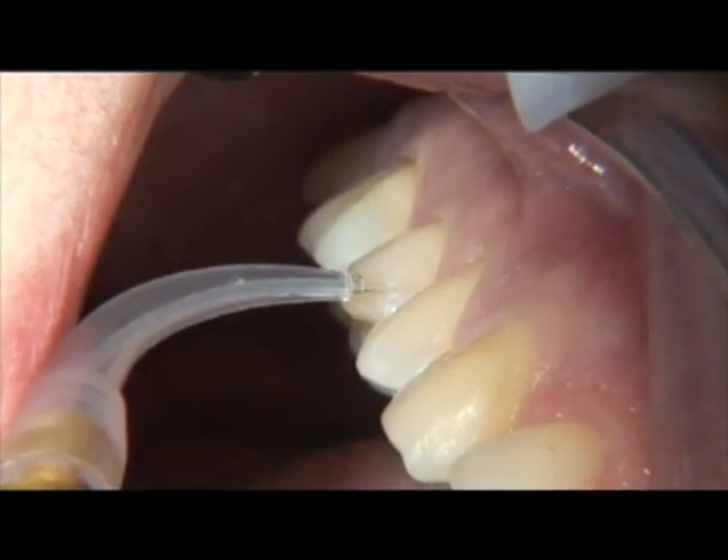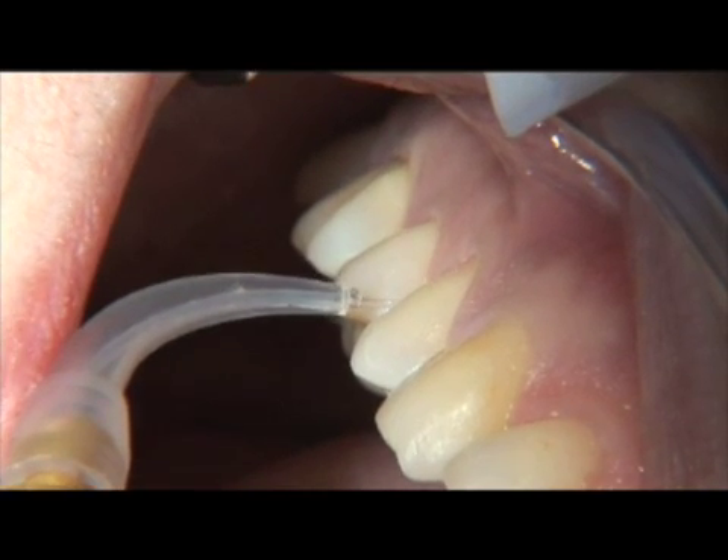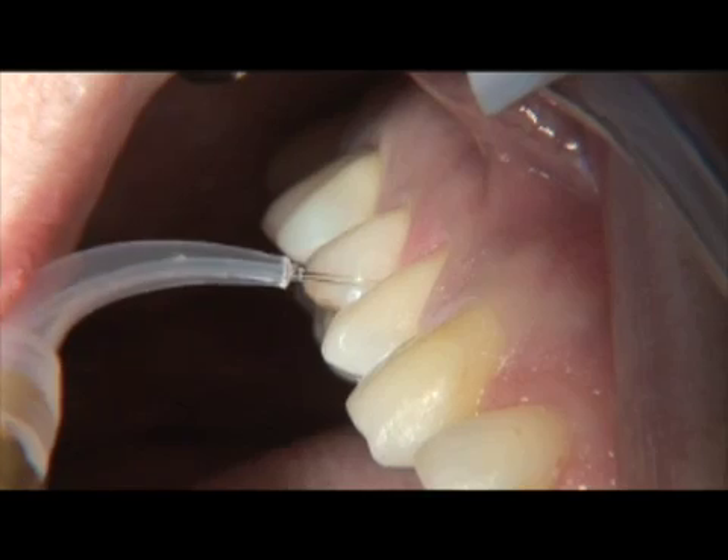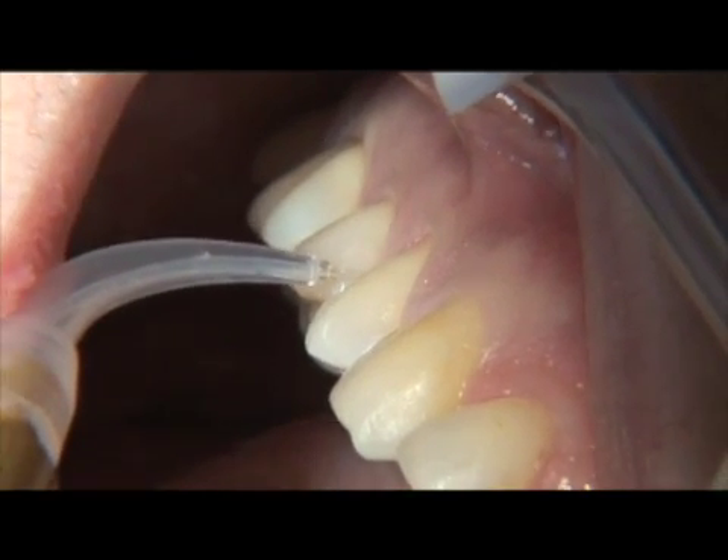One must take care not to strip more than 7 to 8 millimeters of the plastic sheath from the fiber, because the longer it is, the greater the probability of it breaking off below the gum line.